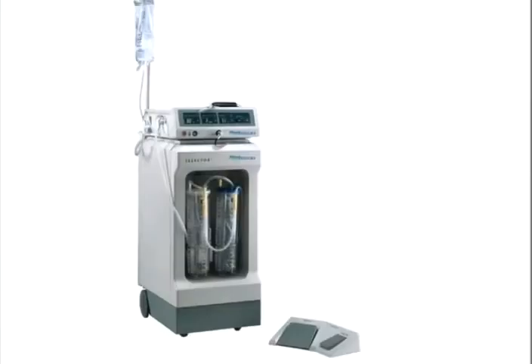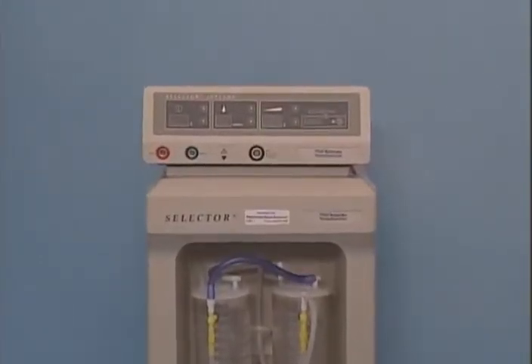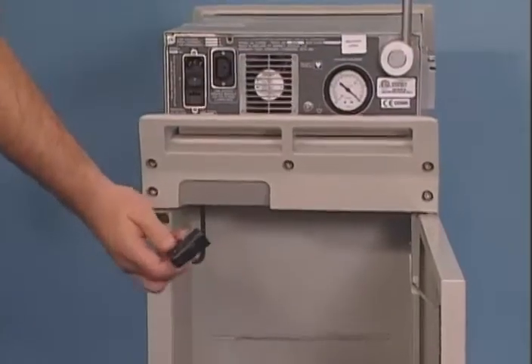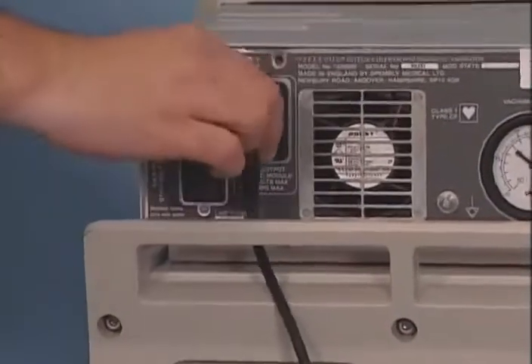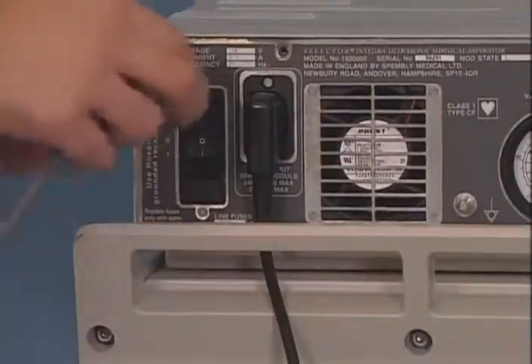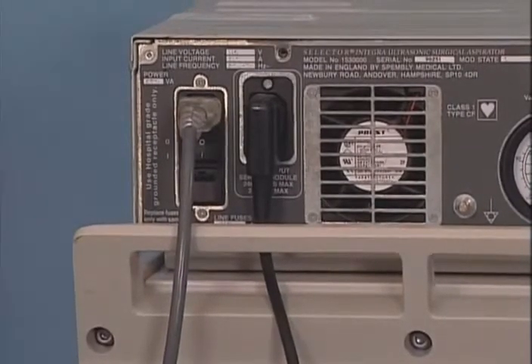This is the SELECTOR Integra console, which is sitting on the service module. Place the system in a convenient position outside of the sterile field. Locate the service module cord and connect into the power outlet located on the left rear panel of the console. Plug the power cord into the mains inlet, which is located on the upper left corner on the rear of the console. Then plug the power cord into the wall receptacle.